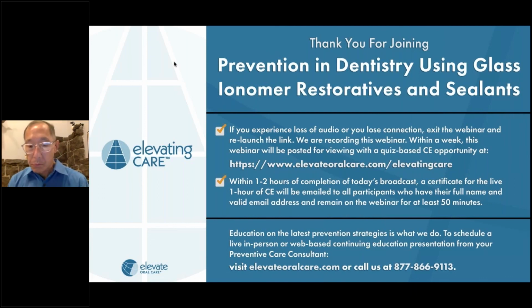Can I just step in there? I totally agree with what Doug said, but there's one more point. Once you finish the restoration, you should place a resin coating and light cure it, because the data that I showed you show that after 80 days, when that resin coating is gone, saliva would improve the physical properties much more than any other strategy that we have. So as a last step before the patient leaves, once it is finished, I would put on more protection there.